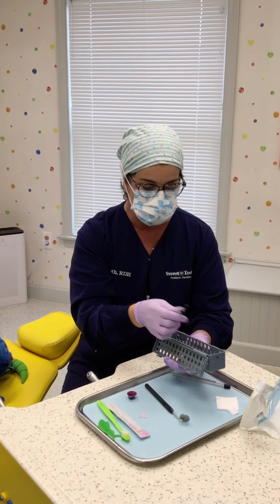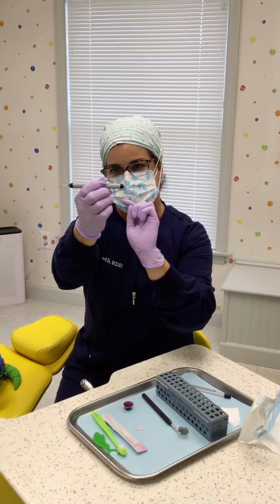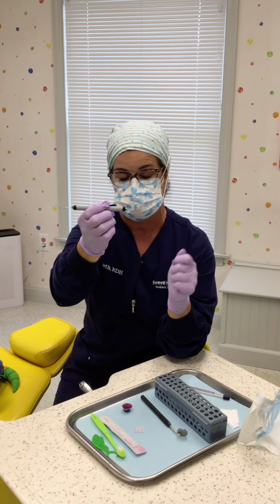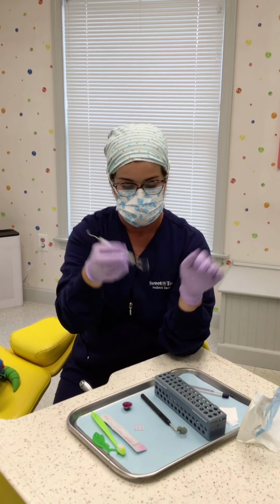We've got a tooth counter. And my tooth counter has two different sides to it. It's got one that's a little bit more pointy on this end and then the other on that. But your teeth should be nice and strong and hard. So what we're going to be doing is when we touch on them, it's just kind of like tapping a little bit to make sure that they do feel strong though.